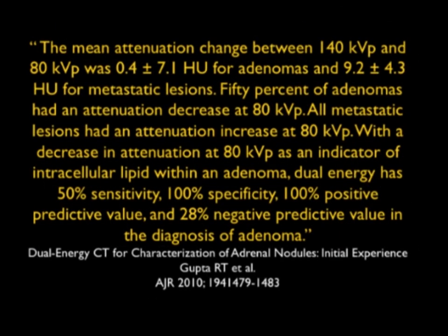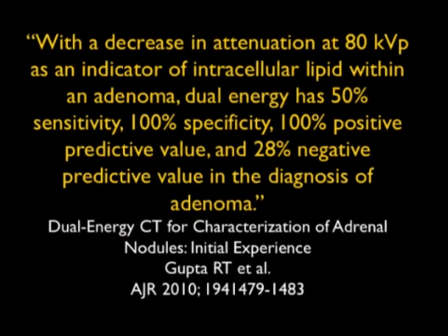This article by Gupta looked at a decrease in attenuation at 80 kVp as an indicator of intracellular lipid within an adenoma. Dual energy had 50% sensitivity, 100% specificity, 100% positive predictive value, and 28% negative predictive value. So there is some hope, and I think like with many things, dual energy is first coming along.